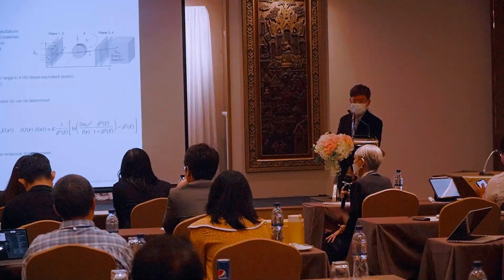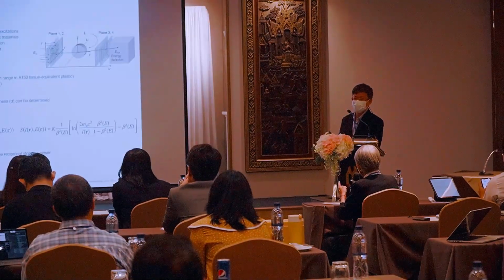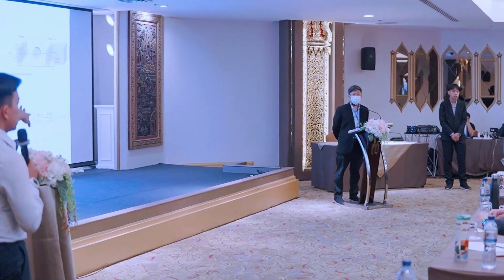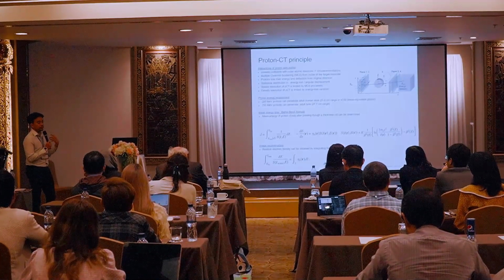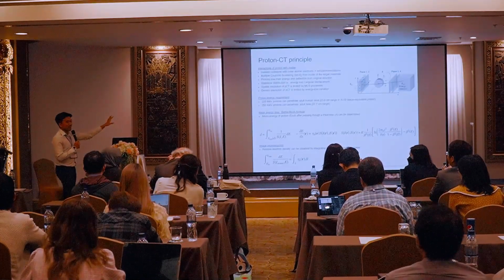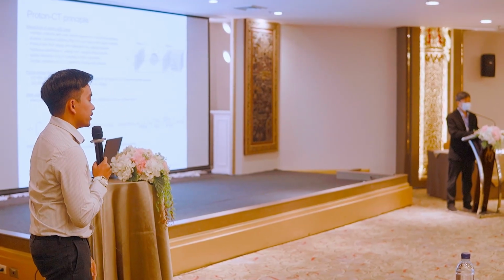But another question concerning protons, which produce neutrons as well. Do you have to take neutron production into account when you shoot protons into the body? Actually, yes, because our calorimeter consists of an absorber. There are many candidates for the absorber, for example copper, aluminum foil, or carbon fiber. You have to think about which one produces less secondary radiation. Now we didn't care about the radiation yet because we have very few materials. We do check with the survey meter, and it's safe for us for sure. But in the future, yes, of course, we have to think about that.